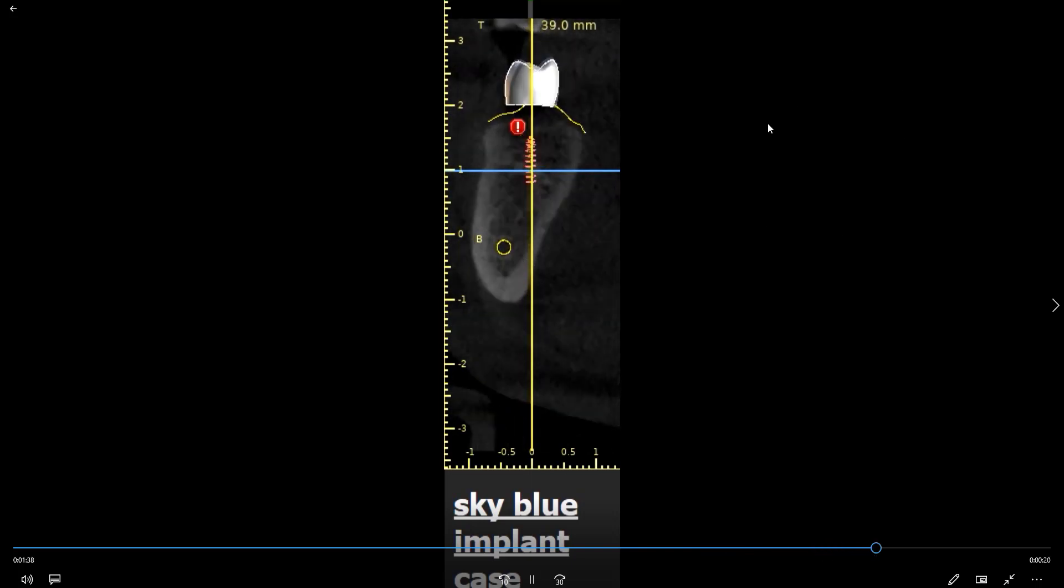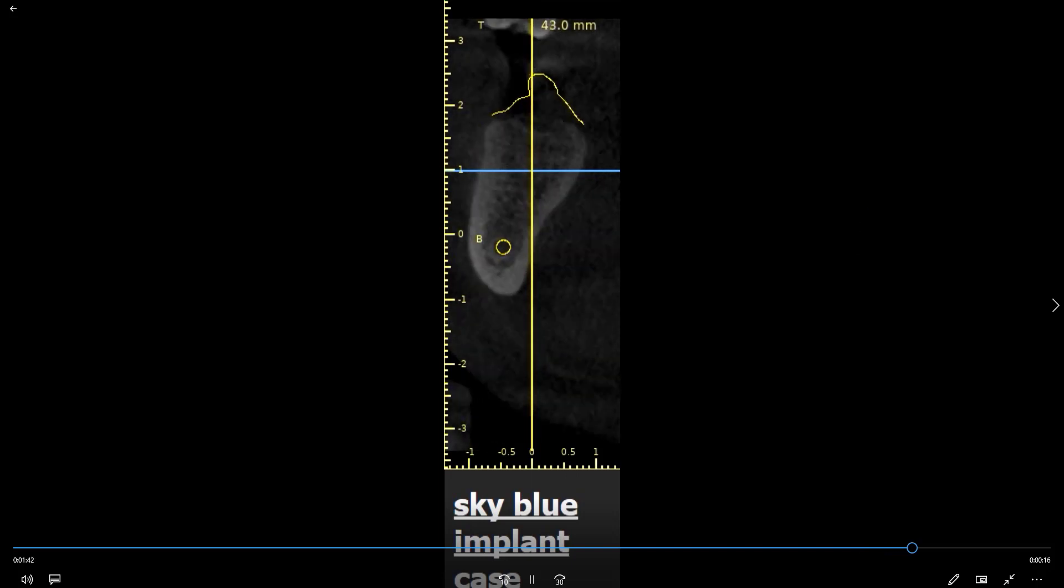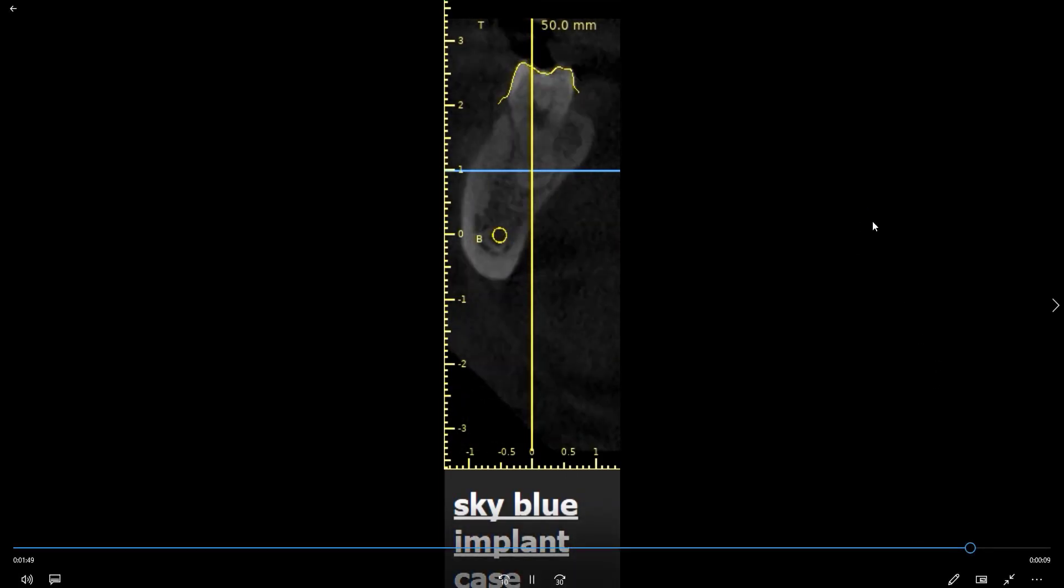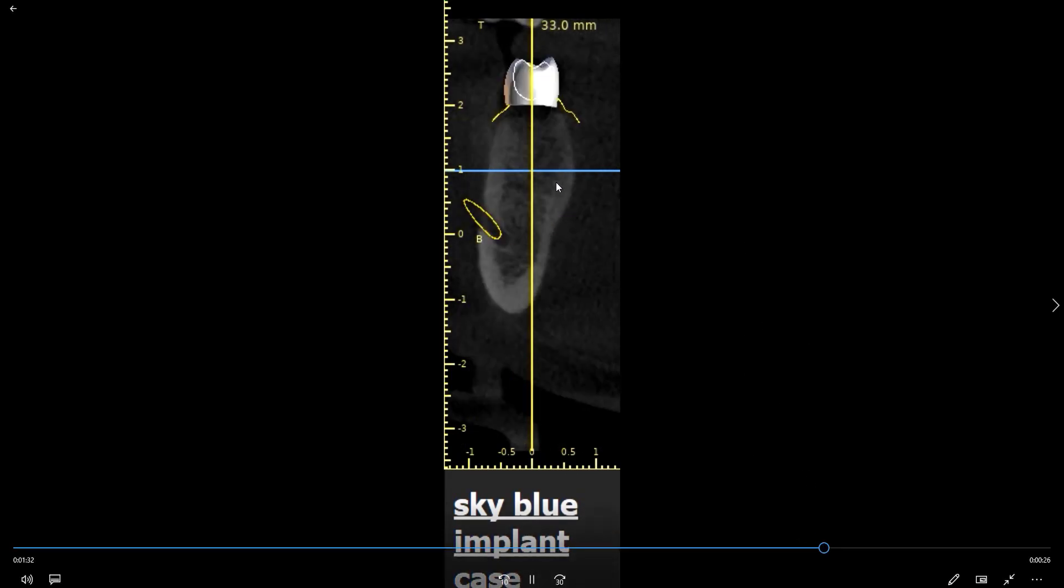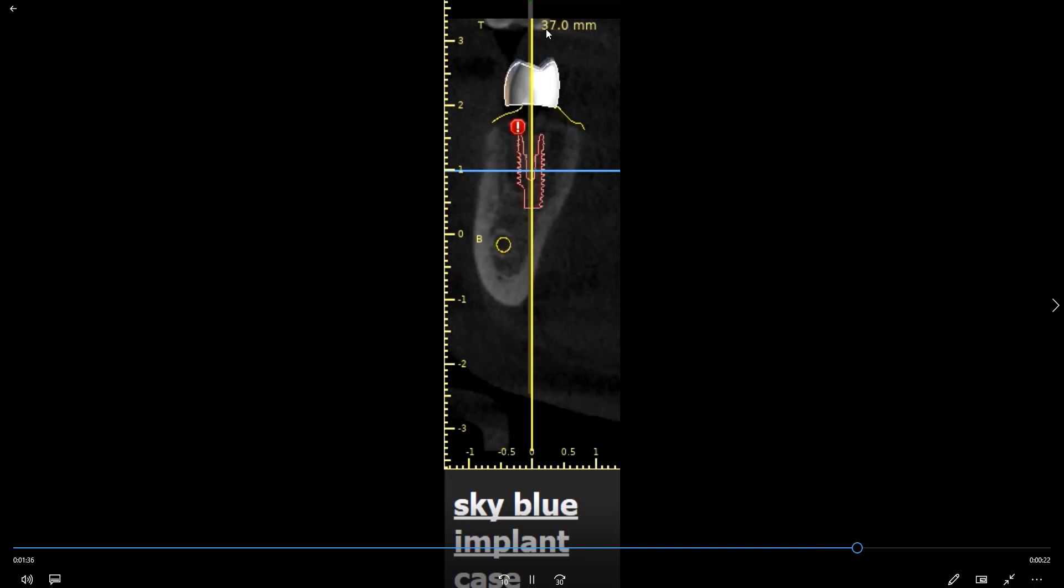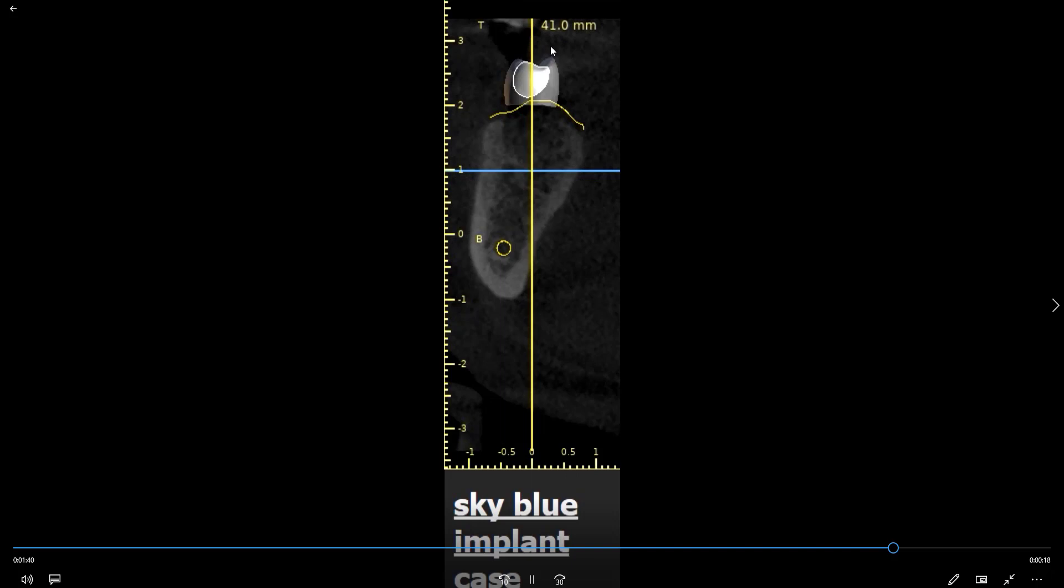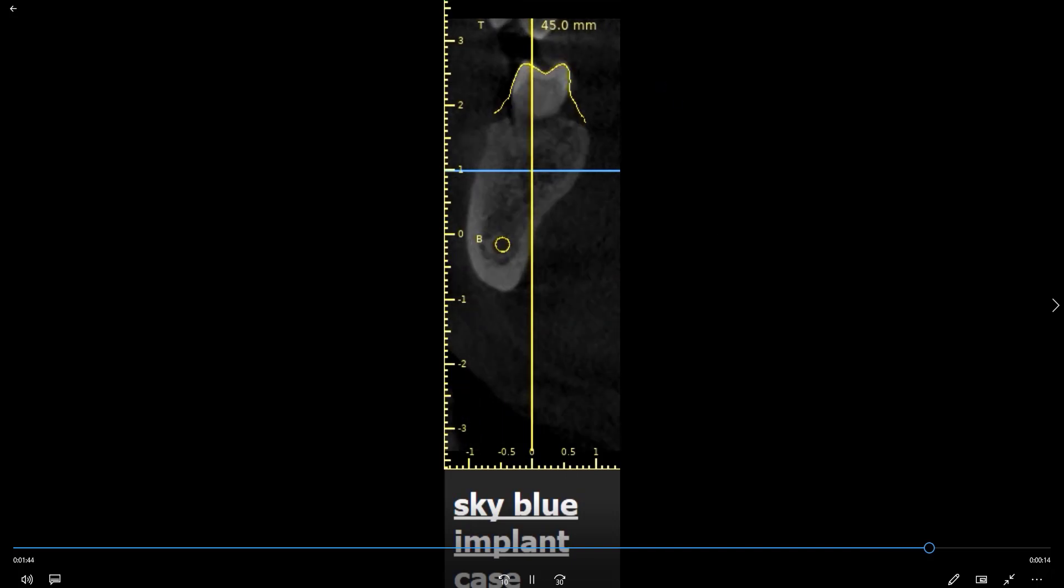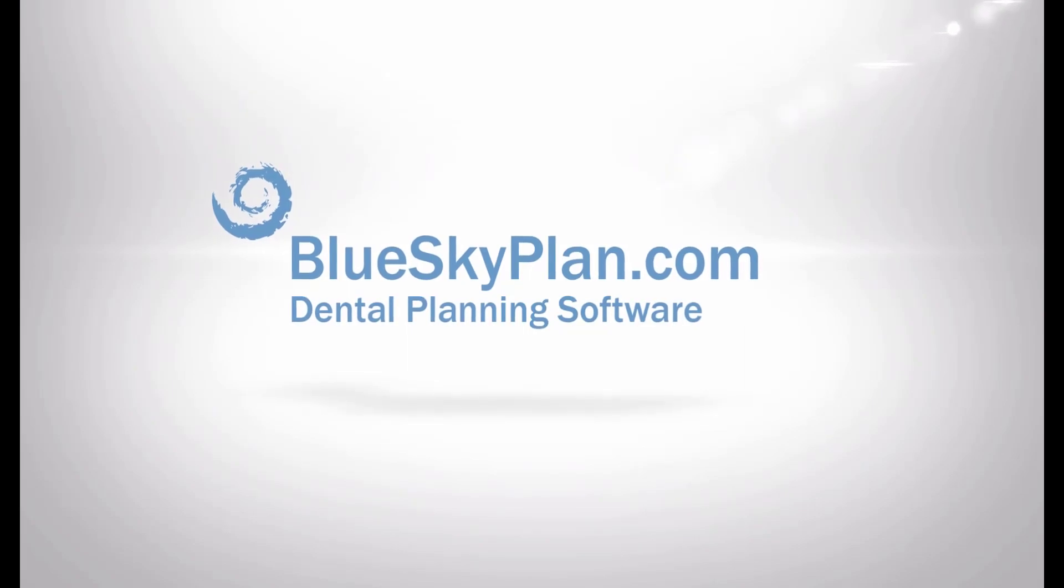And we could see also regarding our implant placement, it just goes slice by slice and shows us the patient's anatomy with the implant planned. And we could see that showing us what we had in our axial view with one millimeter increments between the slices, which is the setting that we had in the actual view of the software. So if we wanted closer or farther separations between the slices, we could change the setting in the Blue Sky Plan software.